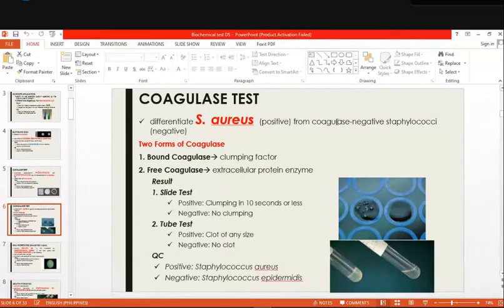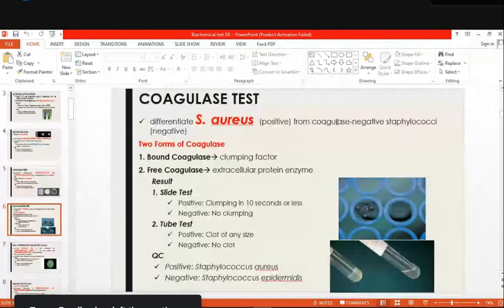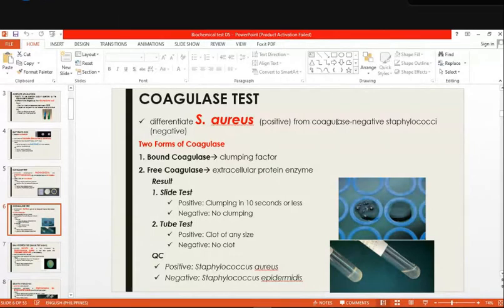And there is a question in your study guide whether you can use EDTA anticoagulant. Sorry, it is citrate that cannot be used. Okay, you can use your EDTA anticoagulant, but you cannot use citrated plasma. Why? Why can't we substitute EDTA with citrate?